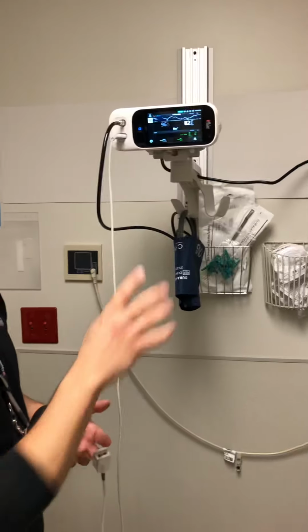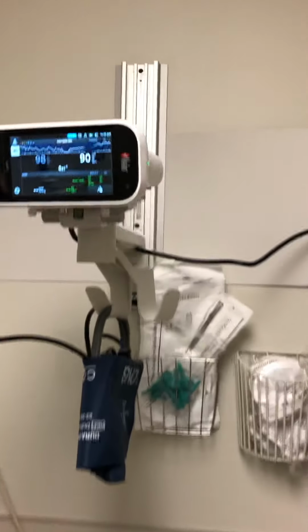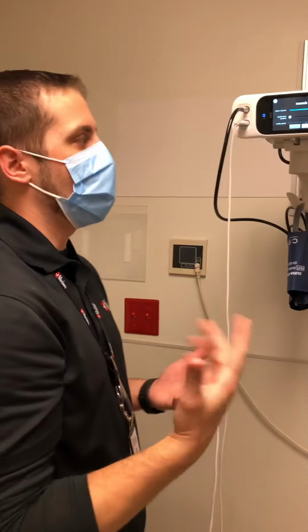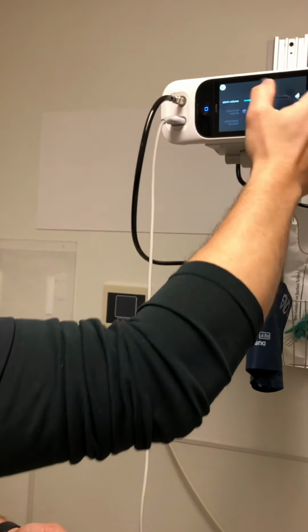Just to show you the buttons at the top of the menu here, the only other icon that you're going to be utilizing is this little speaker button up there. This is where your alarm volume is. Now I will tell you, when I came here today, the alarm volume was all the way at the very top. We don't like doing that. Obviously it's annoying to your patients and annoying to you guys and just overall unnecessary. So as a default, we always put it down to a level 1.